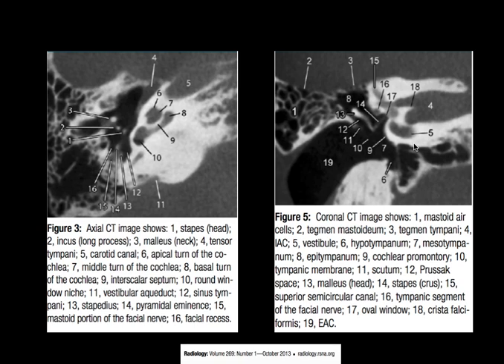Coming to the anatomy of the middle ear cavity — you can see various structures labelled, as given in the RSNA journal. You can see the cochlear promontory very well, the tympanic membrane, and the stapes getting attached to the oval window. You can also see the tympanic segment of the facial nerve. This is the cochlea, with the basal turn, middle, and apical turns visible.